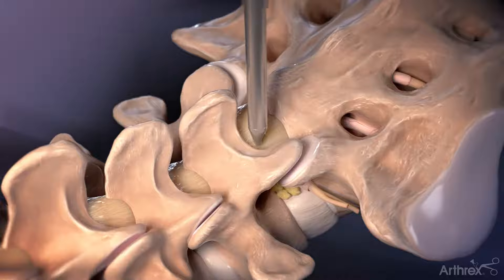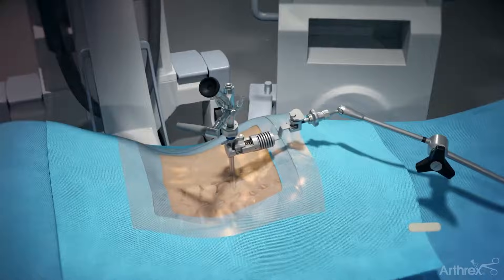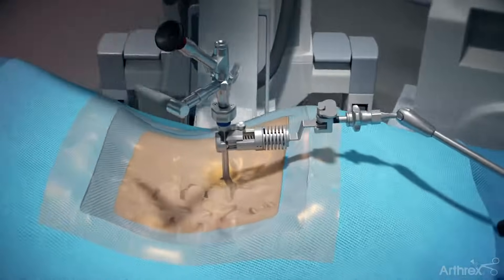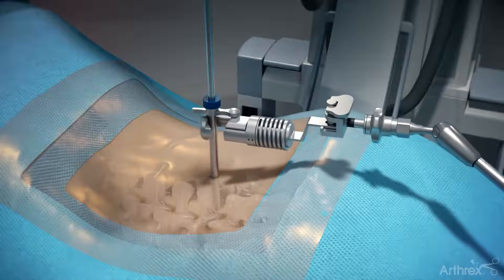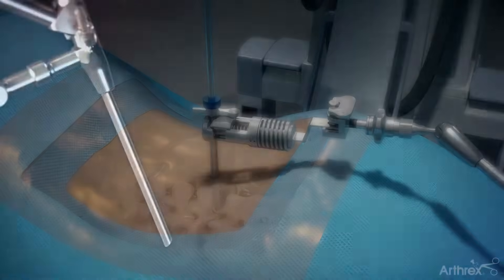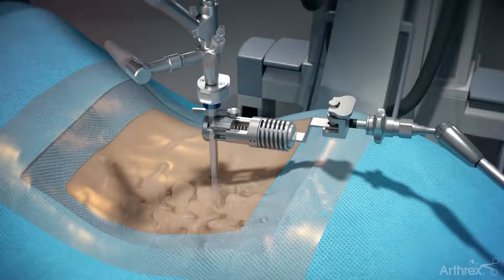Insert the cannula over the switching stick, then remove the switching stick and insert the endoscope. The surgeon may choose to connect the cannula holder to aid in maintaining the trajectory. Connect the holder to the cannula prior to the switching stick being removed. A depth stop may be attached to the endoscope to maintain the depth within the cannula.